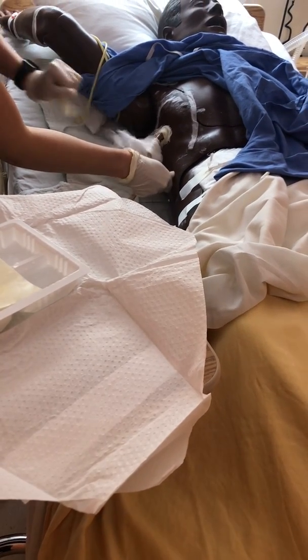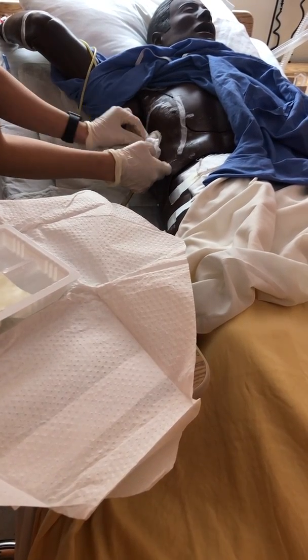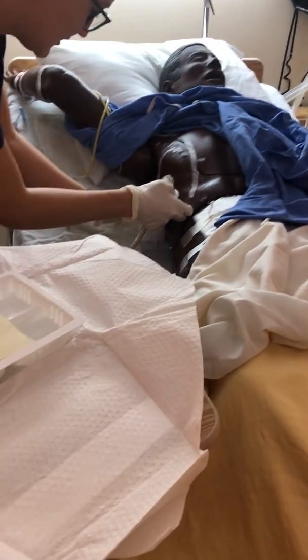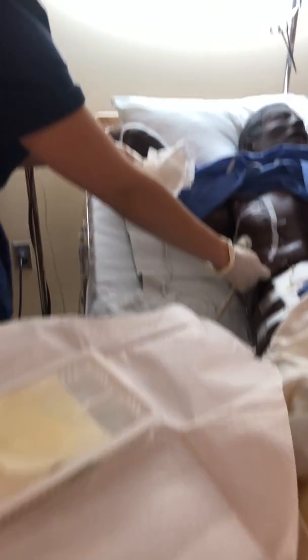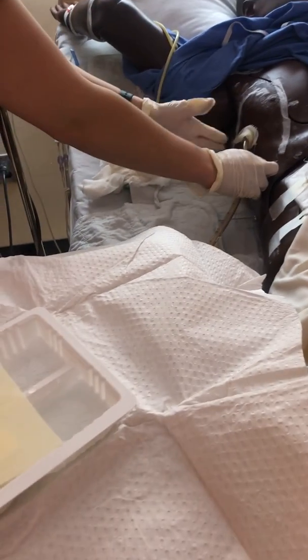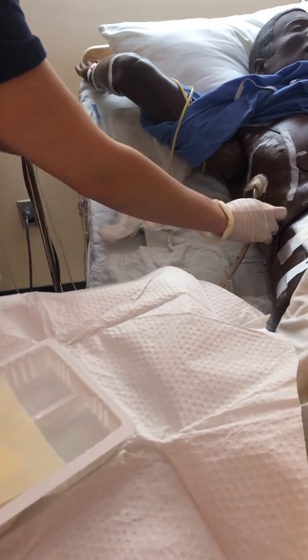And we also got the doctor's order for dressing change. And I want to make sure I'm doing this as gently as possible so that I don't pull out his tube by accident. Okay, so I have his old dressing here. I'm going to assess it for any drainage. And before I took off the dressing, I would have felt around for any subcutaneous emphysema, any crackling, anything like that. And there was none with him.